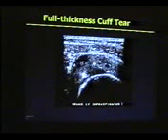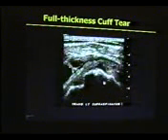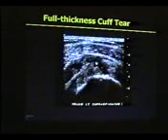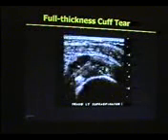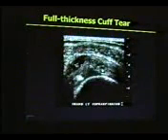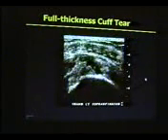Full thickness tear. In real time you can see this clip, and there is full discontinuity of the tendon. So the tendon is torn. You can see the gap between them. So, full thickness tear of supraspinatus.